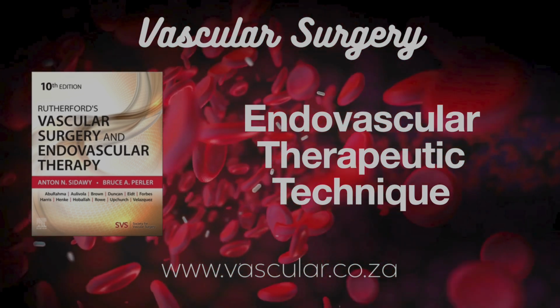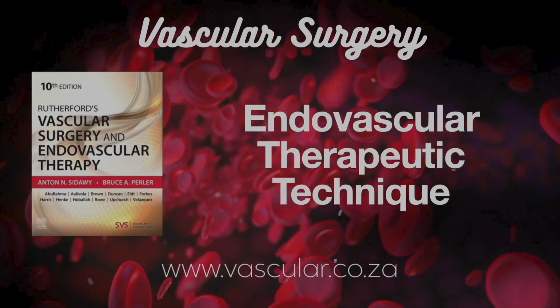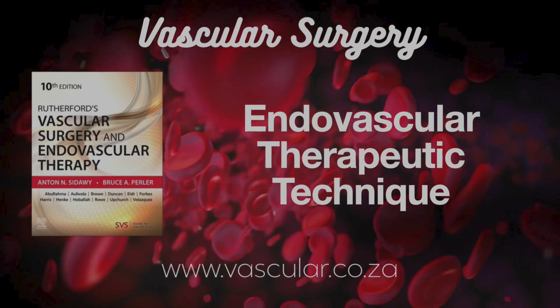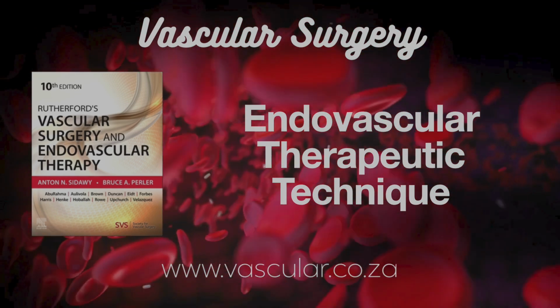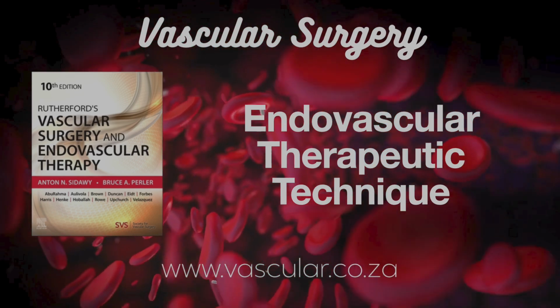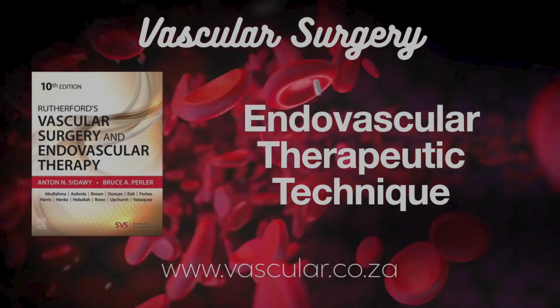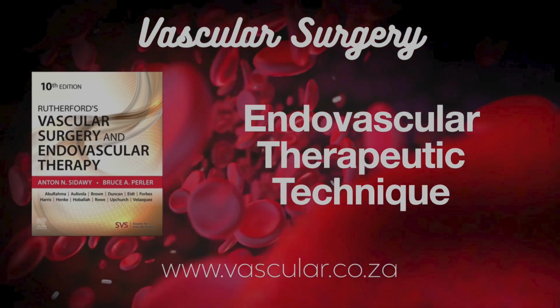So various vascular closure devices, VCDs, were developed. The aim is faster, secure closure without complications like infection or thrombosis. Are VCDs proven better or safer than manual compression? Large trials, like ISAR-CLOSURE in coronary patients, and meta-analyses generally show comparable rates of major vascular complications, not clearly superior in terms of safety overall. So why use them? Often it comes down to patient comfort, getting them up and walking sooner, efficiency for staff, especially with those large sheaths where manual compression is really tough.